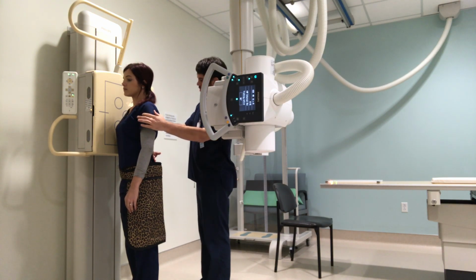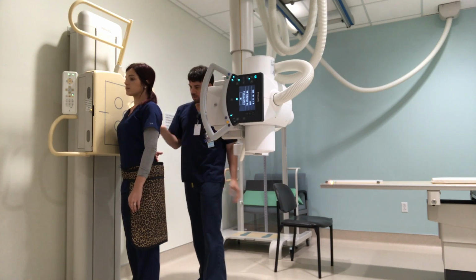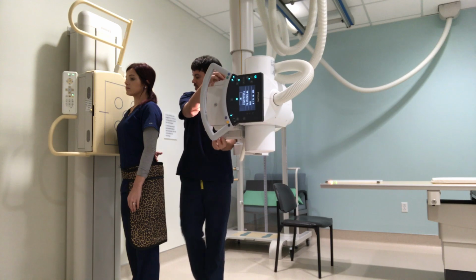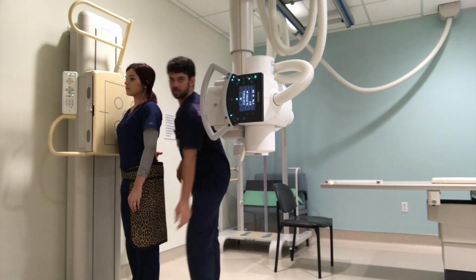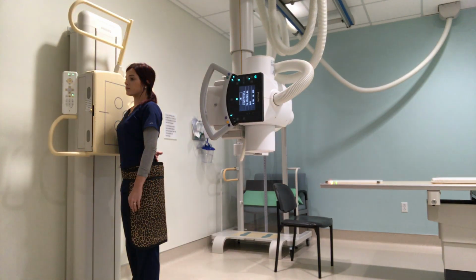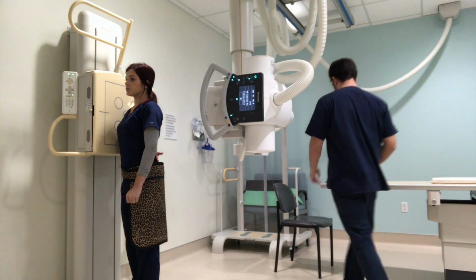All right, and so I'm going to get my CR to enter directly on the medial border and collimate in slightly, because you don't need as much field of light on this one. All right, and I move my marker to the lateral side. X-ray. All right, we're all done with the standing images, ma'am.